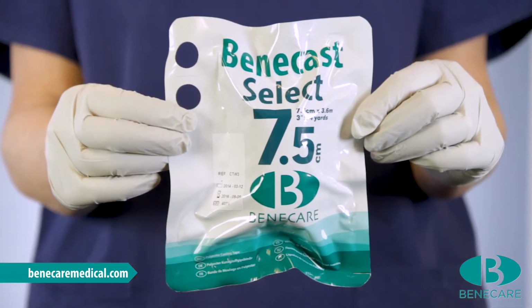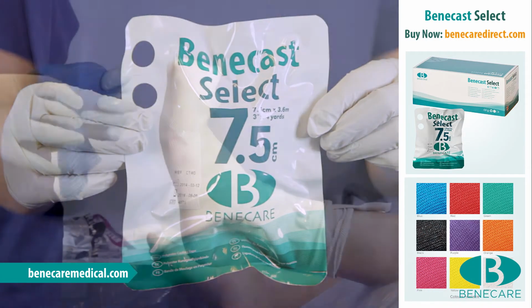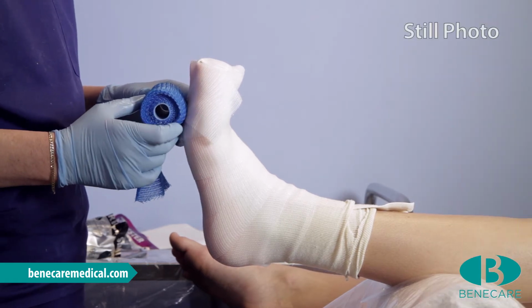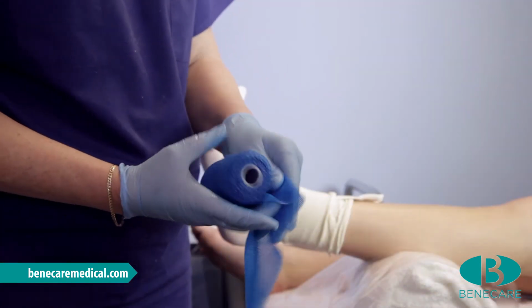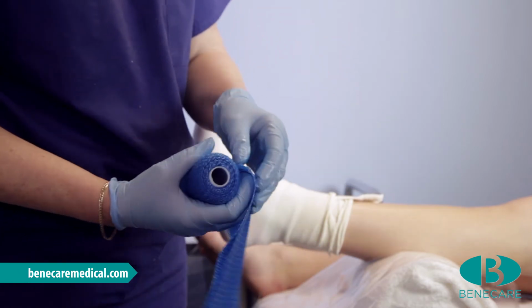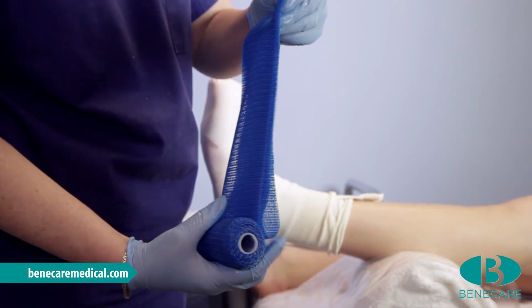Using the Benecast polyester, remove from the pouch. This needs to fit the widest part of the foot, which is usually the metatarsal heads. Measure from the heel to the toes and then make a 4-layer slab. This is the minimum and is dependent on the patient's body size and functionality. This could be increased to 6 or more layers.